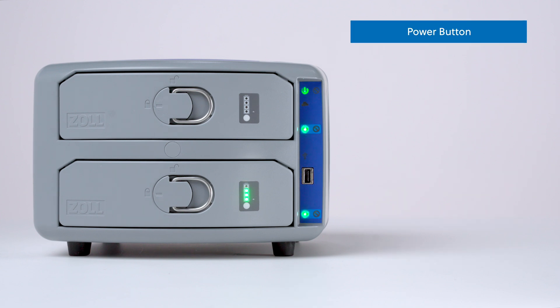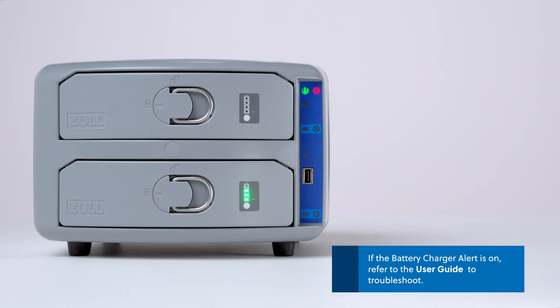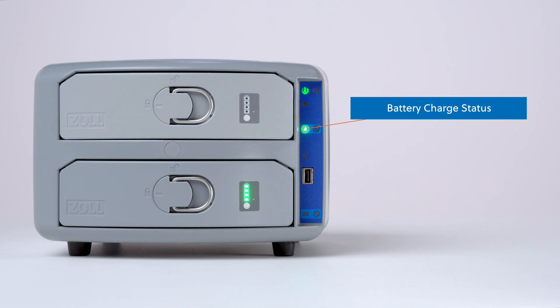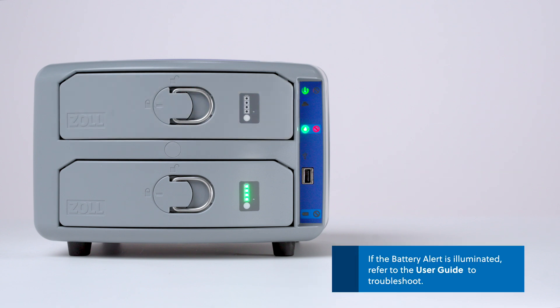The power indicator will illuminate when the charger is plugged in and has power. The battery charger alert will illuminate if the battery charger is on but requires attention. If the battery charger alert is on, refer to the user guide to troubleshoot. The battery charge status illuminates for the battery in the applicable bay. The corresponding battery alert will illuminate if the bay is not working. If the alert is illuminated, refer to the user guide to troubleshoot.